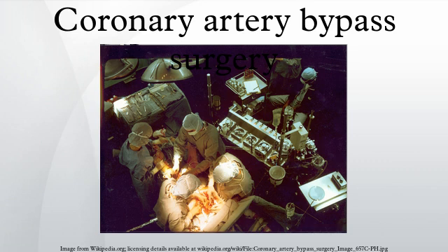This surgery is usually performed with the heart stopped, necessitating the usage of cardiopulmonary bypass. Techniques are available to perform CABG on a beating heart, so-called off-pump surgery.